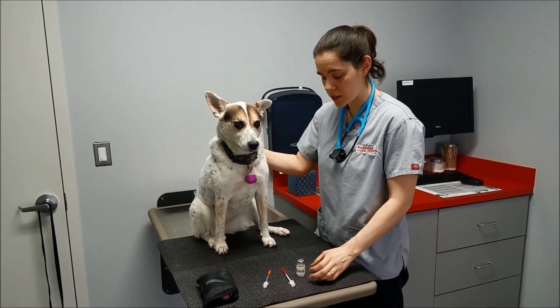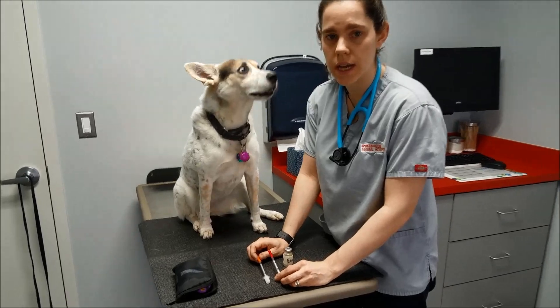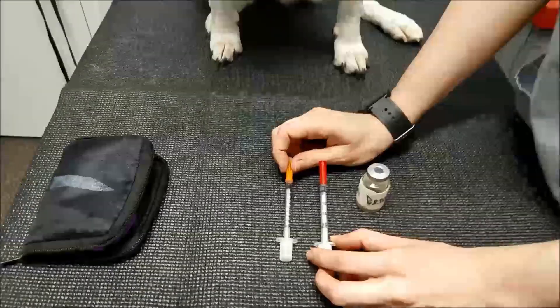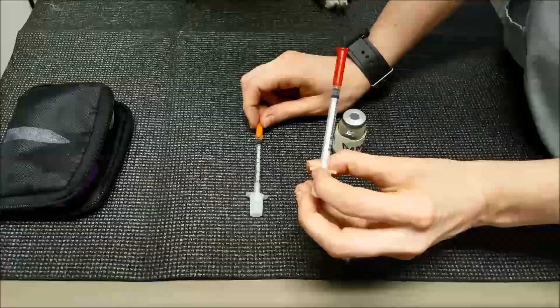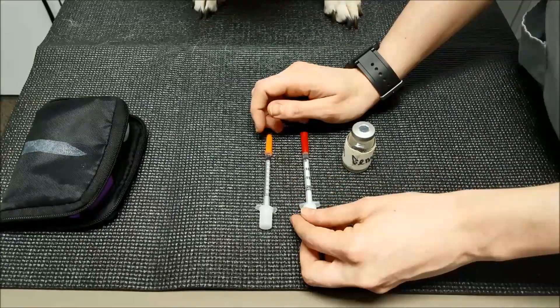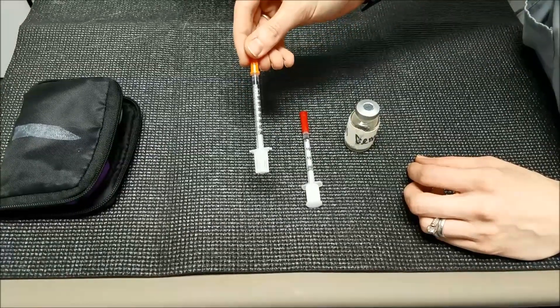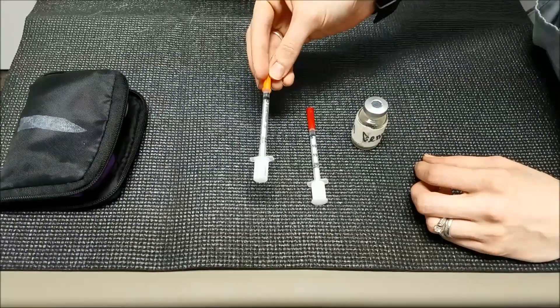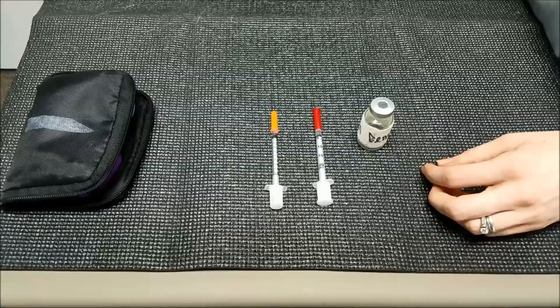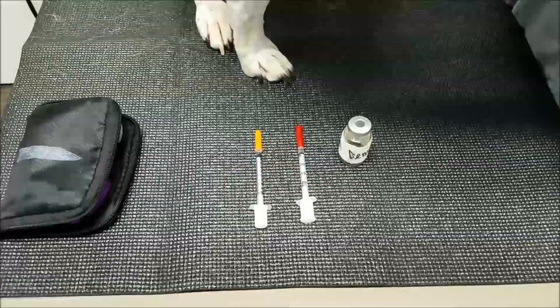And now we're gonna do our insulin injection. I wanted to note that there are two different types of syringes that you're going to be experiencing. One's a U40, which is basically meant only for a U40 insulin such as Vetsulin. And then we have the U100 syringes that are used with U100 insulin, such as Novolin N.